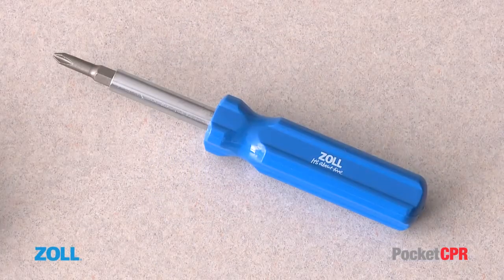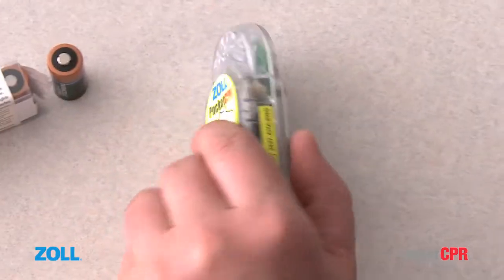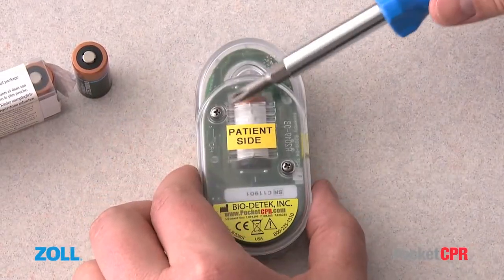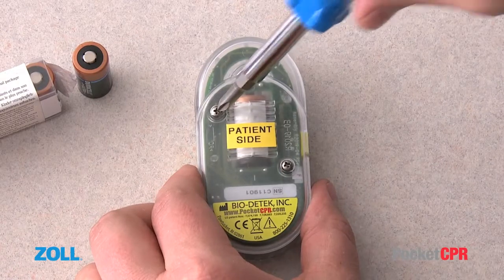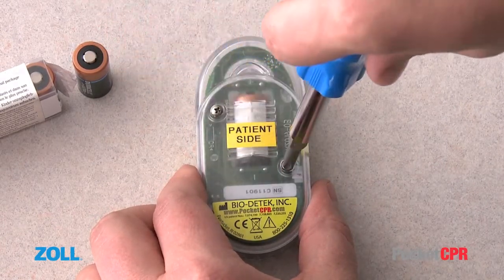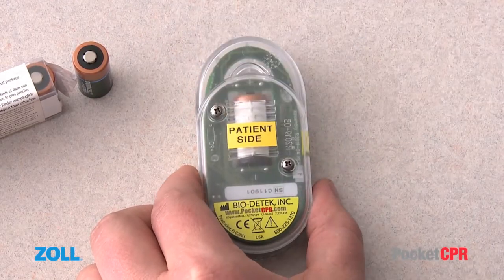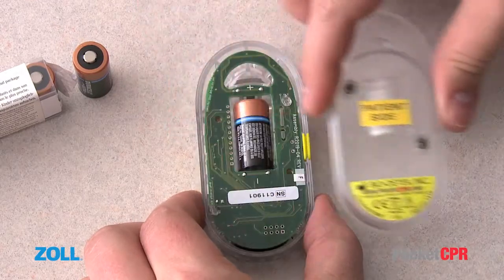To replace the battery, you will need a screwdriver. On the bottom, patient side of the device, you will see 2 screws. Loosen the 2 screws by gently turning each of them counterclockwise until they are fully loosened. Gently remove the bottom cover of the PocketCPR.